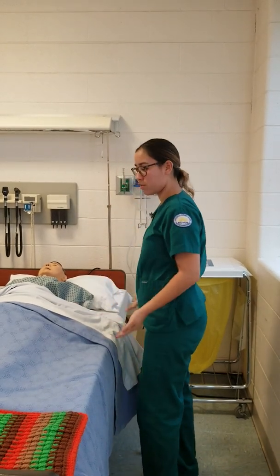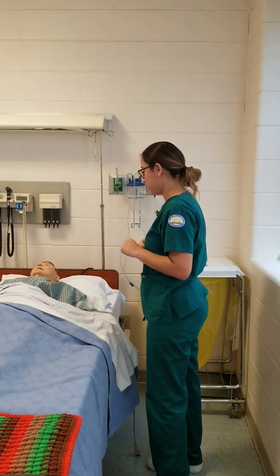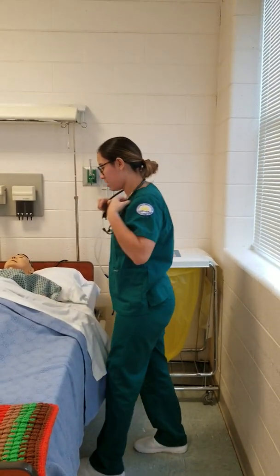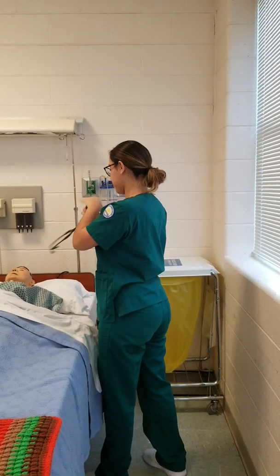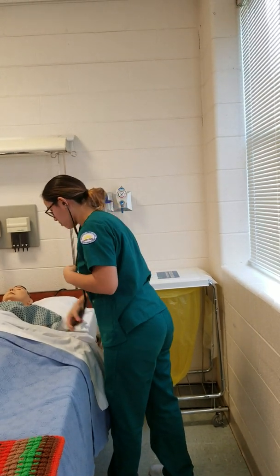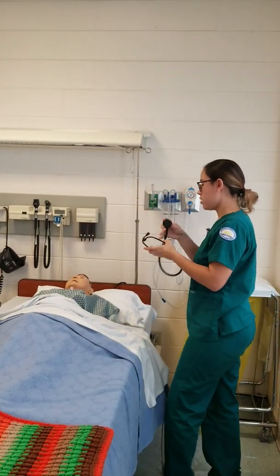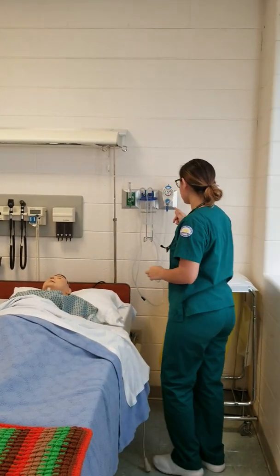Alright, so I'm here today because I heard you have some secretions. I'm going to go ahead and be suctioning some of them from your trach. Is that okay with you? Okay, I would raise the bed to a comfortable position and I would listen to the patient.